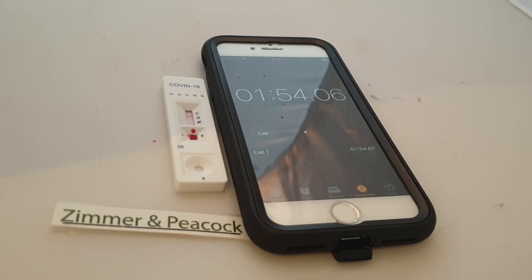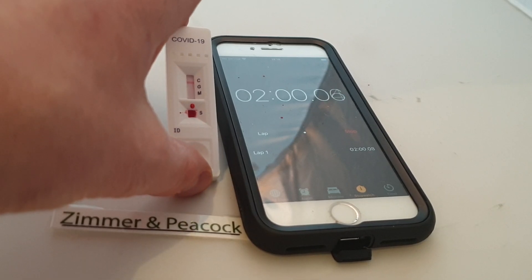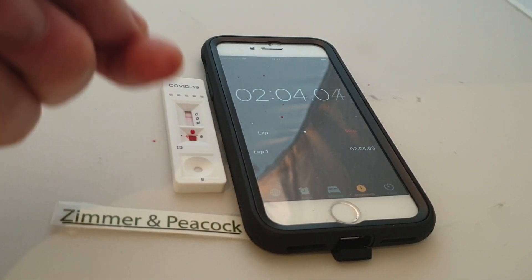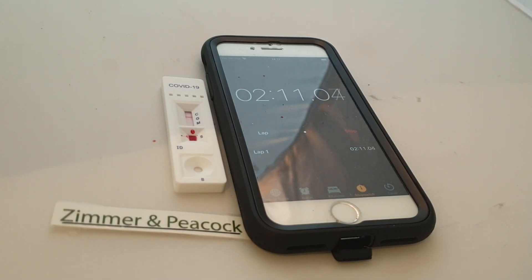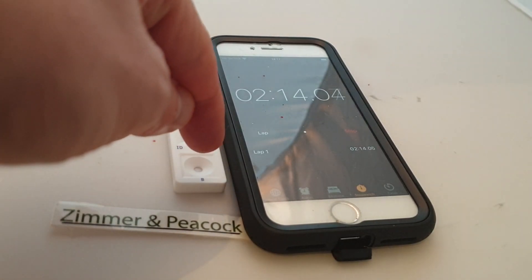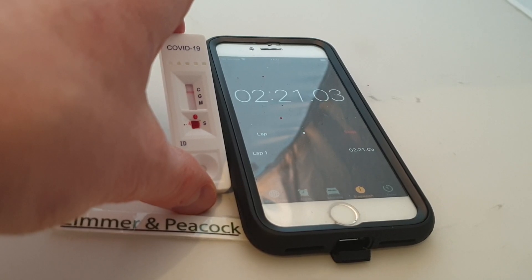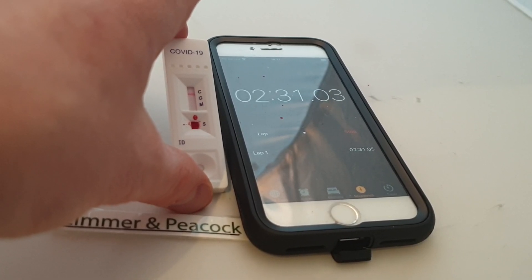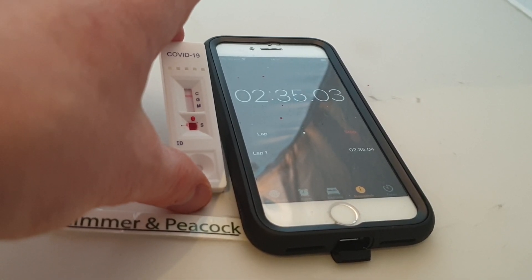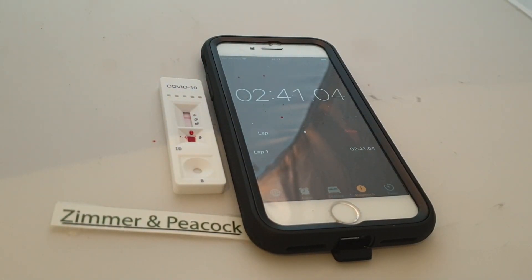To summarize: we have a COVID-19 test. I put a drop of blood onto the little sample window, and then two drops of solution. You saw that the liquid travels up, picks up my blood, and carries it up to the viewing window. As long as I get that red band at C, that tells me the control is okay and the lateral flow device is working. But as you can see so far, nothing on G and M — and I'll leave that running for a few minutes to see if anything happens.